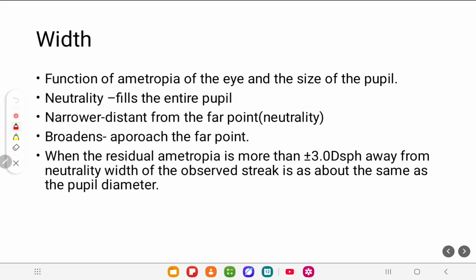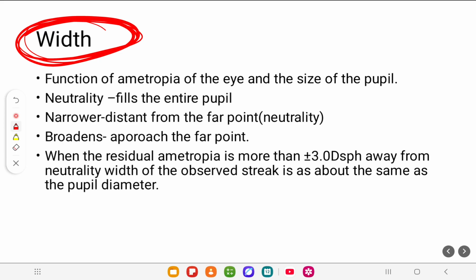Okay. Width is so important in clinical setup with the patients. I always look at the width. I don't know why I look at the width, but I love width. I do not rely on many more things, just width and the direction. I always think in terms of width, and in thought I always think of brightness. And believe me, I'm good at refraction, and I do refractions in a very speedy manner, but width is centrally important.